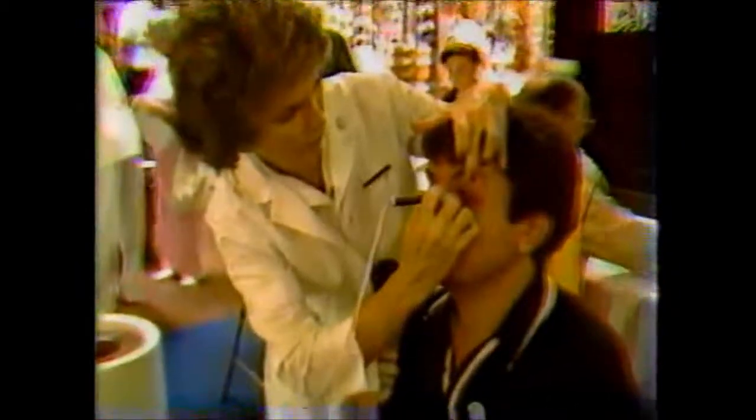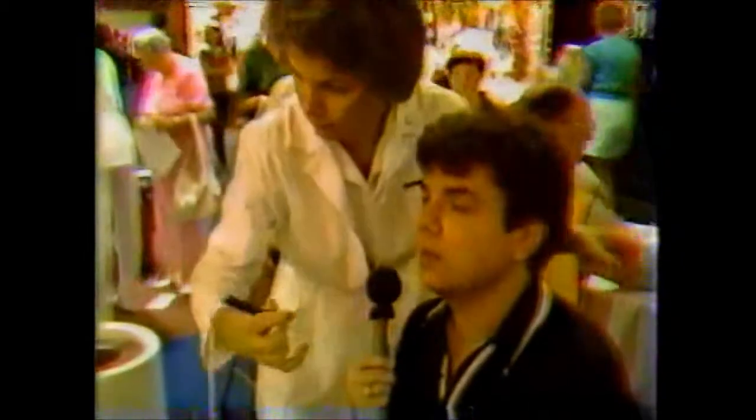Stare, stare, stare. Okay, you're normal. You're the first person that said that today. Perhaps in my entire life. Your eye pressure is okay. Okay, you want to do it again every year.